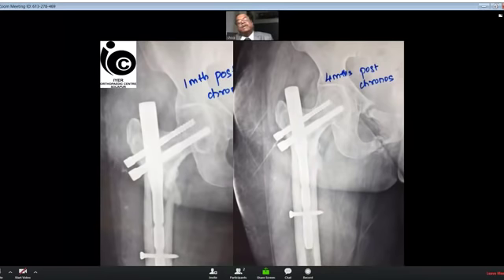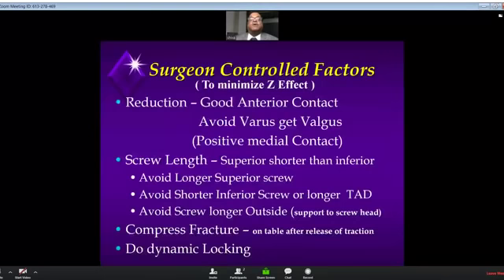And these are the only 2 X-rays I have got where reinsertion of the screw or changing of the nail and reinsertion of the screw, the success has been obtained. If anybody has got a successful story like this, please do share with me.